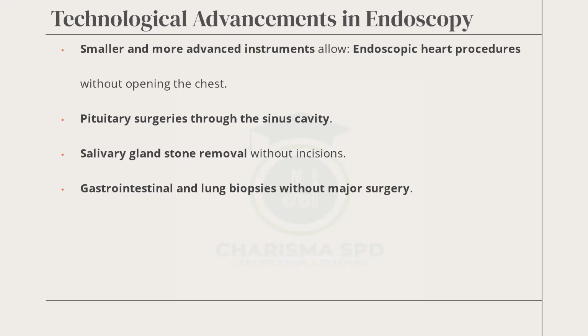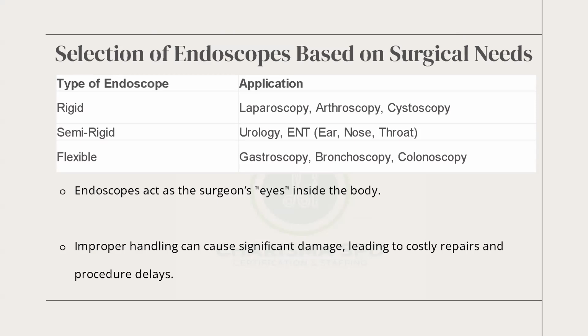Then pituitary surgeries through the sinus cavity. Salivary gland stone removal without incision. Gastrointestinal and lung biopsies without major surgeries. All these things have been made possible because of what? Advancement of endoscopes. It makes it easier for them to go in without having to make big openings.